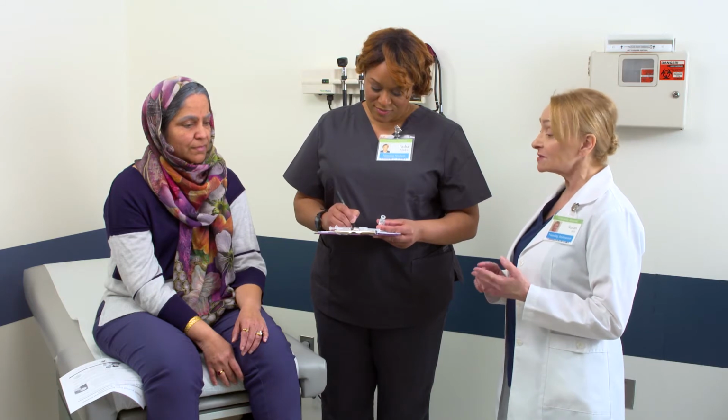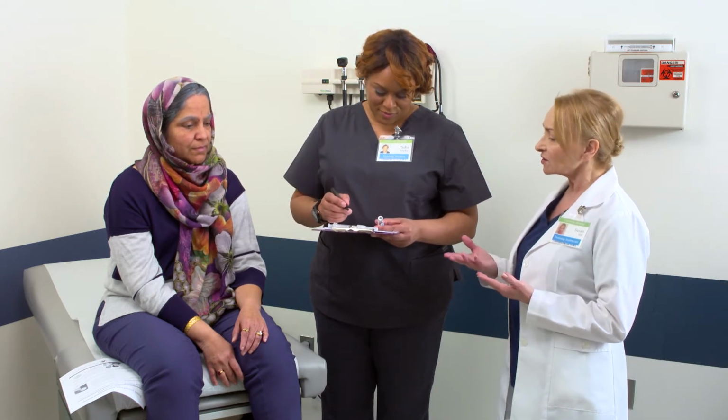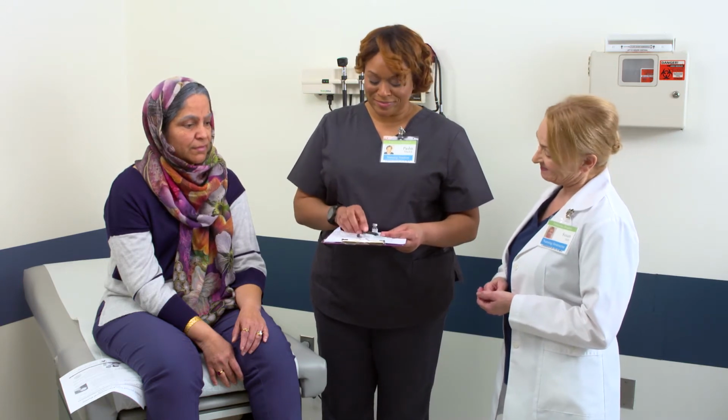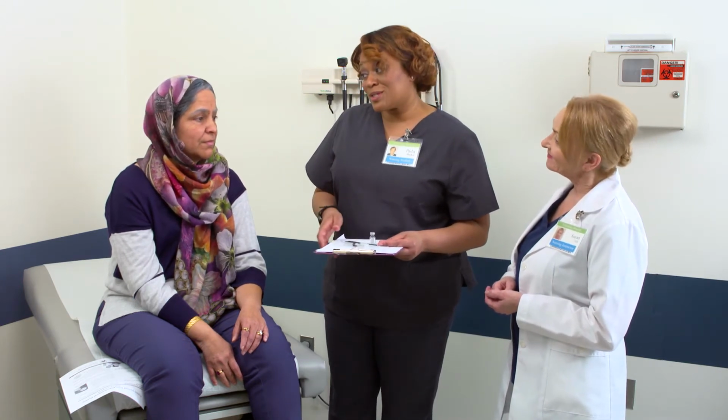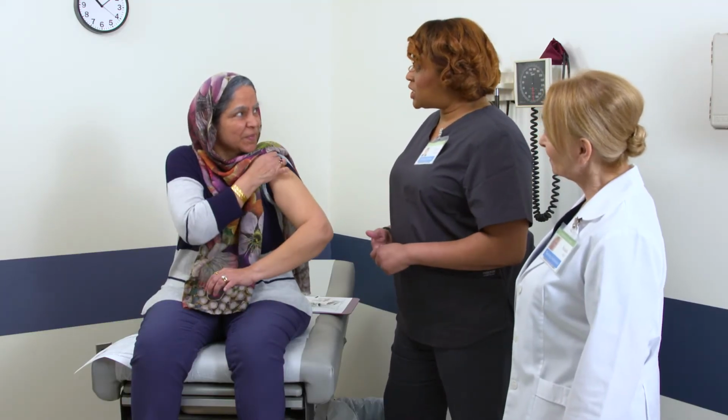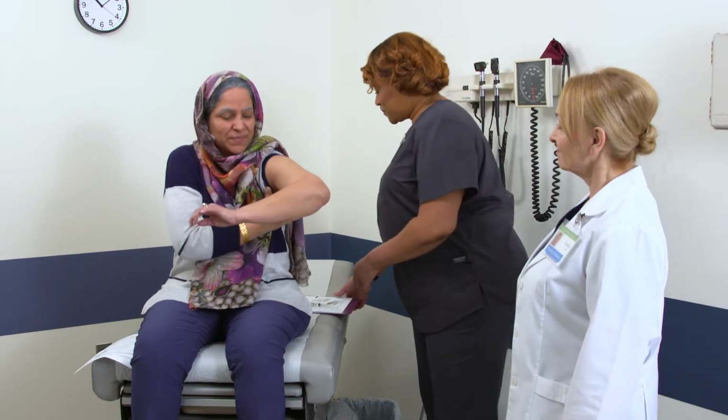You did a good job using your resources, your computer, your nurse, and me. Thanks, Ms. Hill. I'm ready when you are, Mrs. Khan. Let's get this over with. Can we use my left arm? Sure. I just need to do some hand hygiene and put some gloves on, okay?